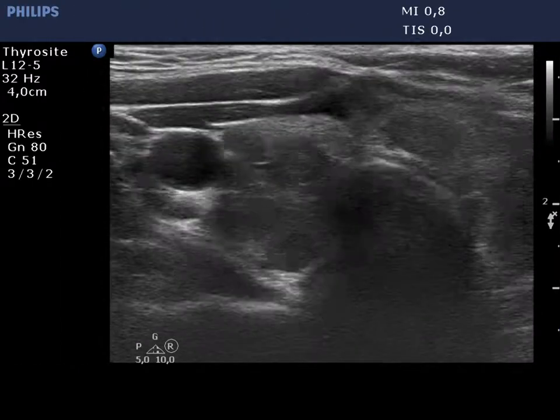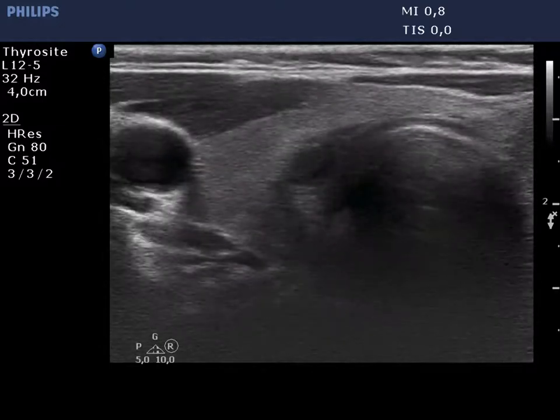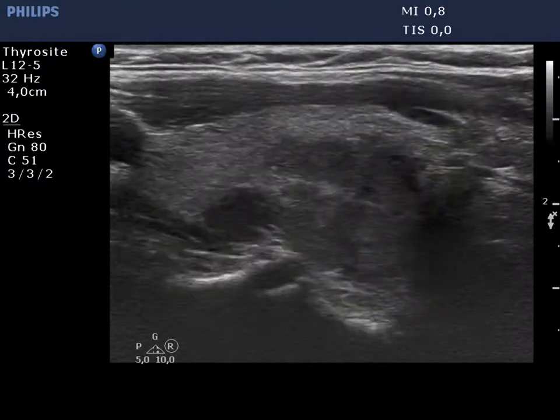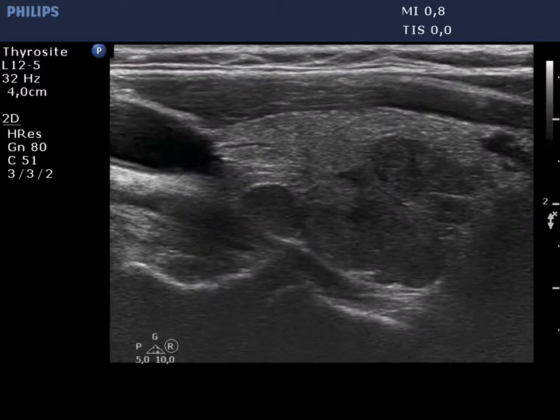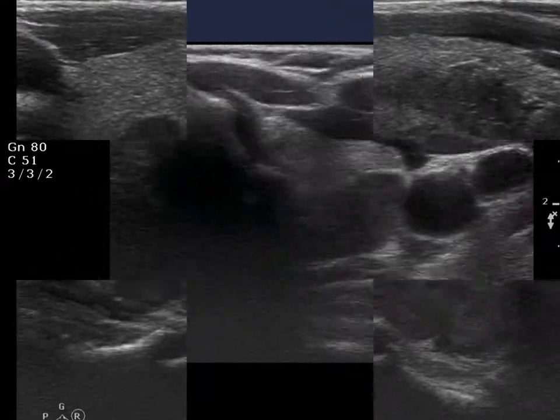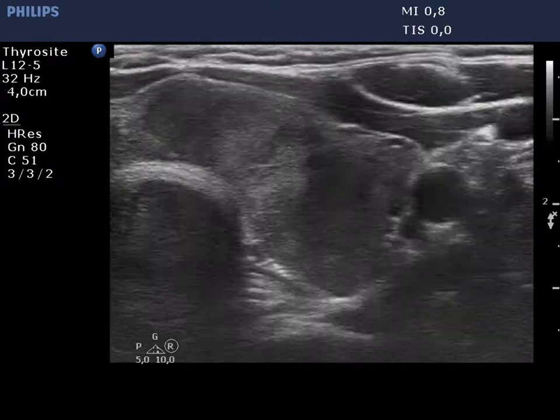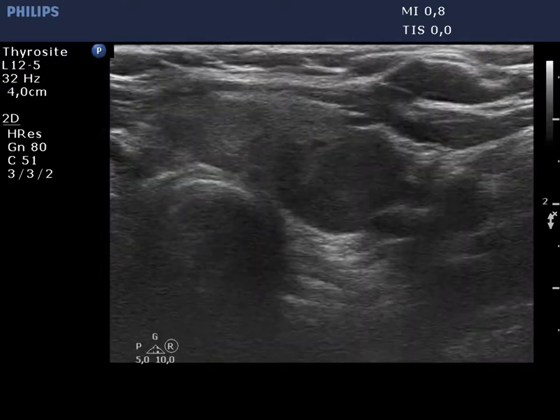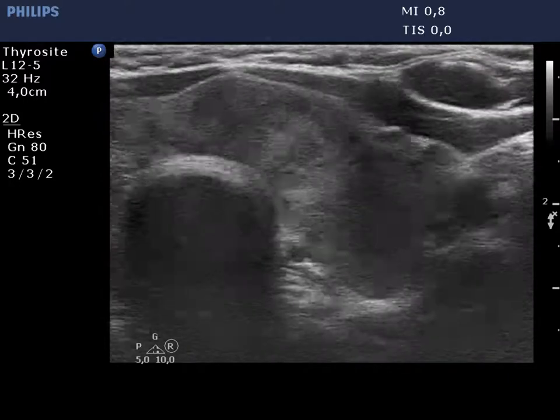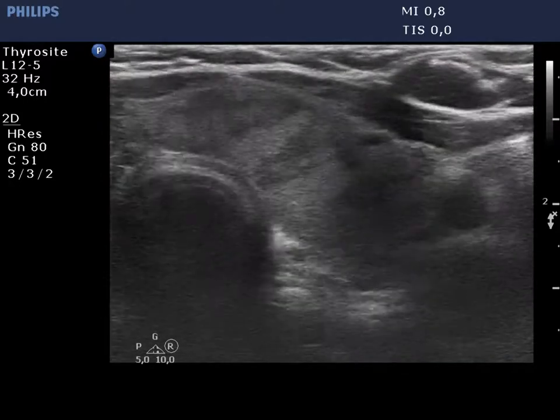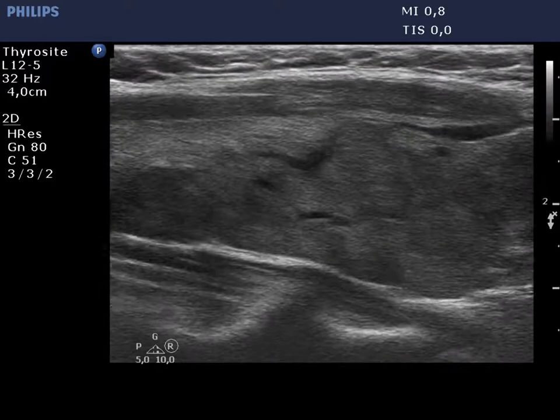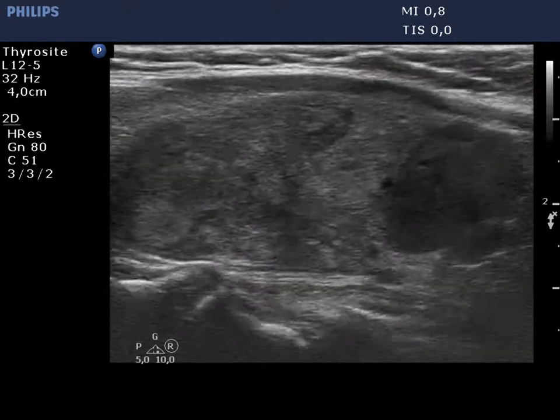The thyroid is echonormal and has numerous discrete hypoechogenic areas. It would be unusual in the event of a multinodular goiter that these lesions are located in only one part of the lobe. The left lobe has a similar appearance; the discrete areas occupy the greater part of the left lobe and are partly echonormal. The presentation corresponds to a micronodular pattern.